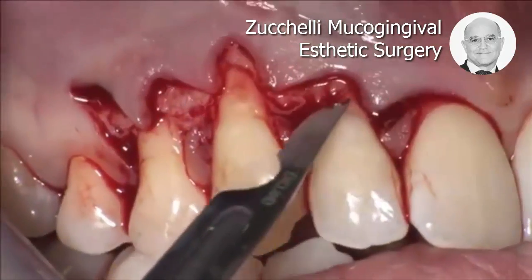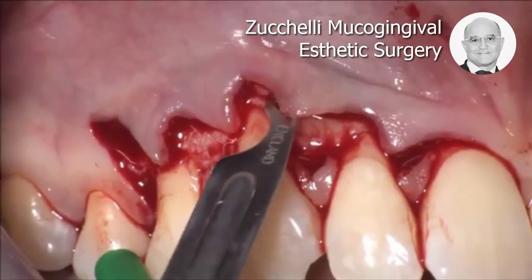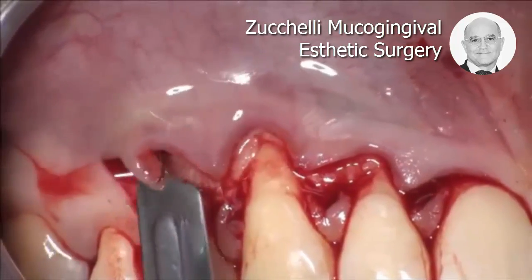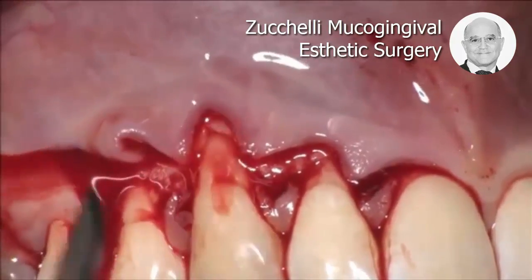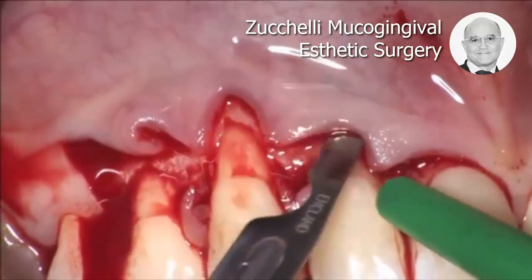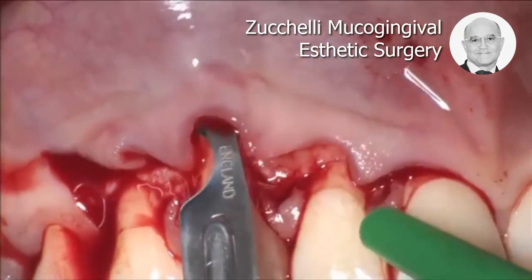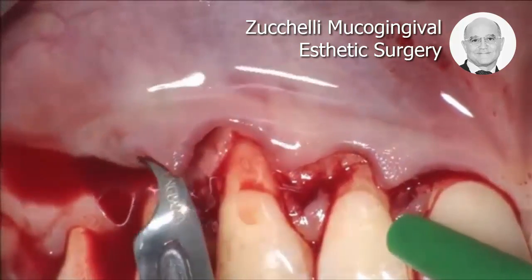So now, it's possible to change the inclination, and instead of being parallel to the bone, I start to be parallel to the lining mucosa, and I'm using my blade to detach all muscles. There is still muscle to remove from the bone, and now I can make my blade parallel to the lining mucosa, and this is how it is done.